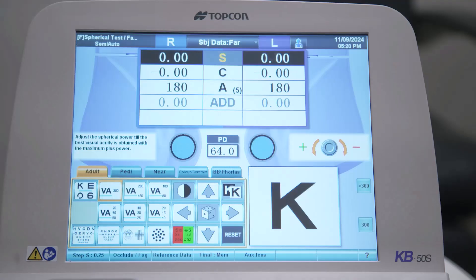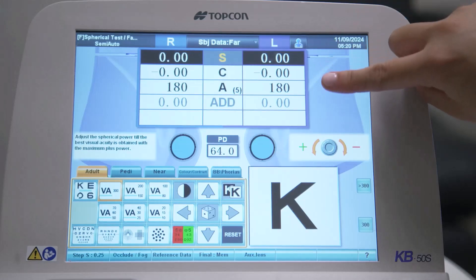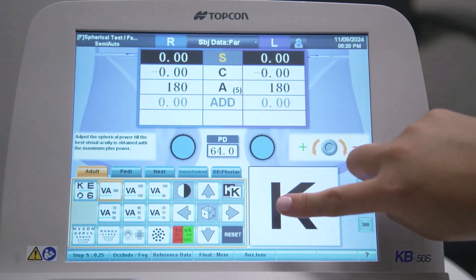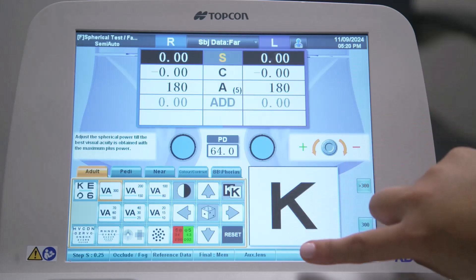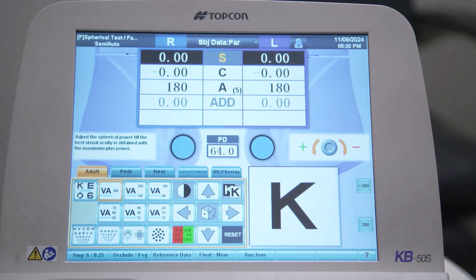The touch screen can be divided into three main areas: the data display area at the top, the visual acuity area in the middle, and the function button bar along the bottom.